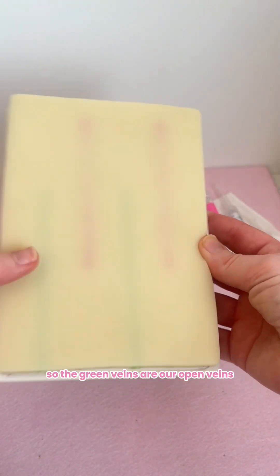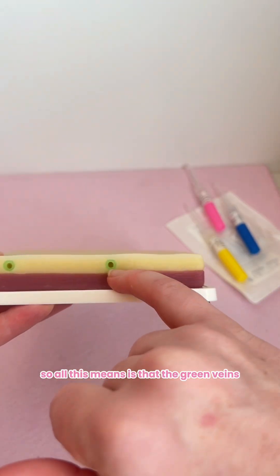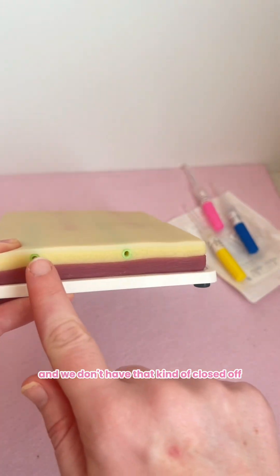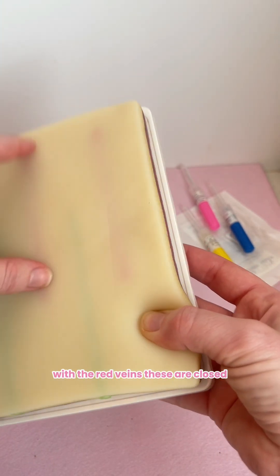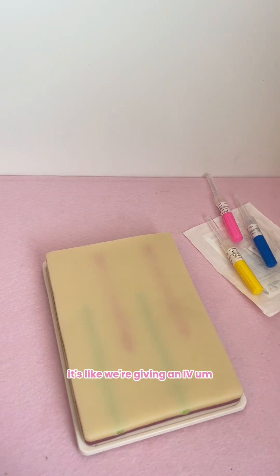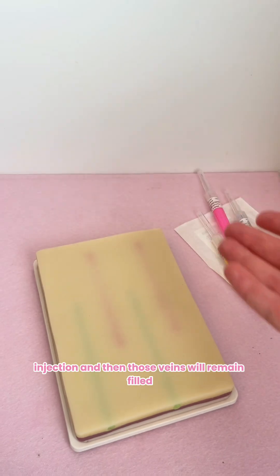So we've got a couple of things. The green veins are our open veins and the red veins are our closed veins. The green veins are open on each end, so if we put our fake blood into these without closing them off, the liquid will just fall out. With the red veins, these are closed, so when we fill these it's like we're giving an IV injection and those veins will remain filled.